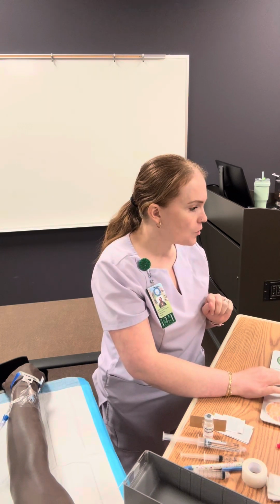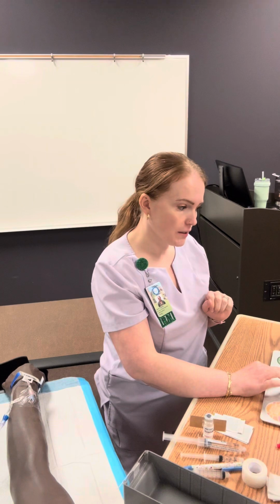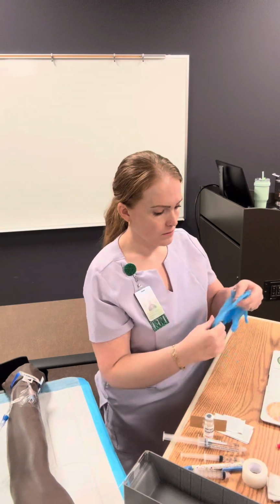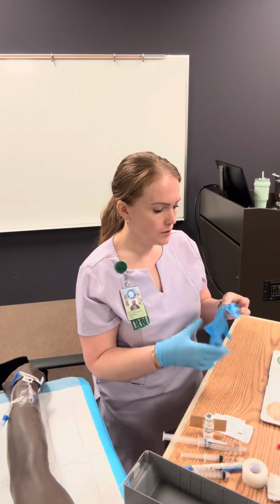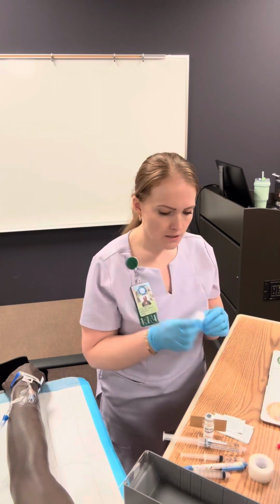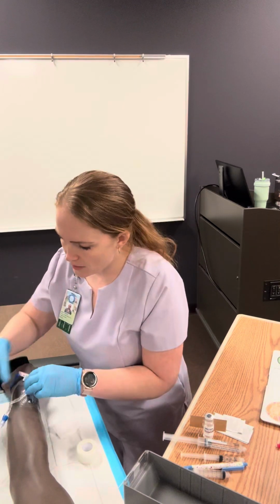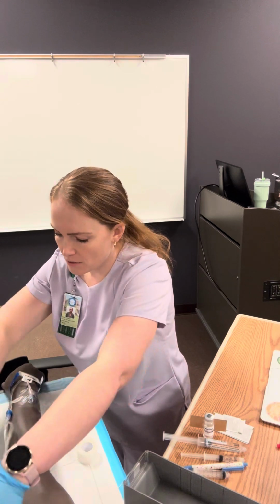I am already going to open up my flow sheets to the interventions, lines, and drains because I will be charting this removal next. So I am going to put on gloves. And I'm noting the site. How does it look? Is there any pain, redness, anything along those sites? I have gauze and I have tape. I'm gonna get that tape pulled up and ready to go. Make sure everything is clamped here so that we don't have any excess fluid running off on me.